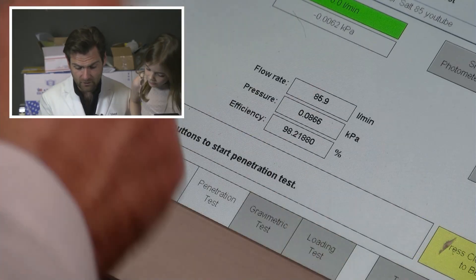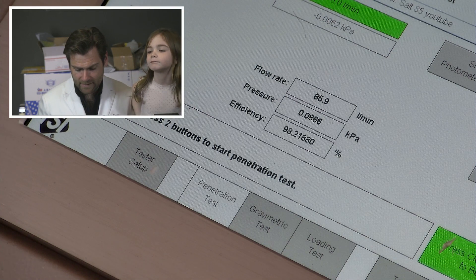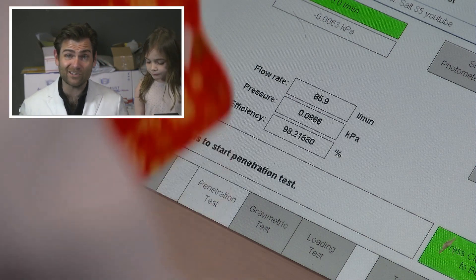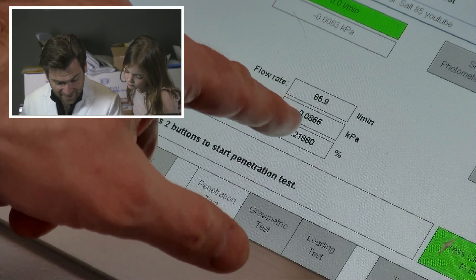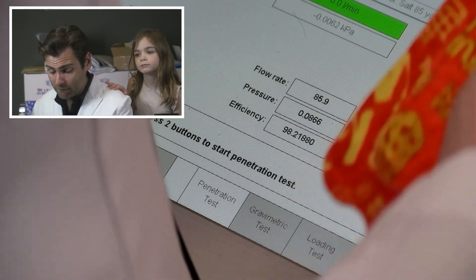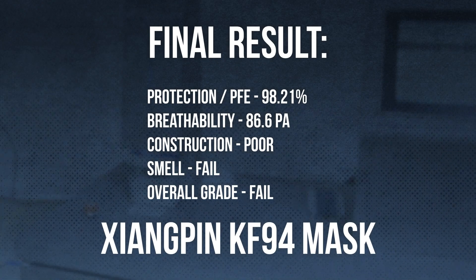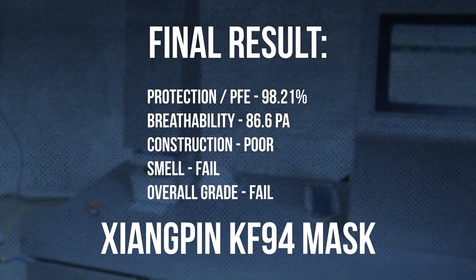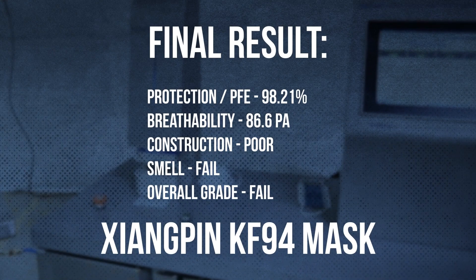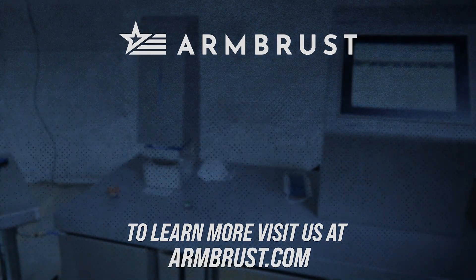It says 98.21. That's a good mask. Very soft — I'd wear that, it's so soft. And the 86.6 pascals — super breathable. So butter cookies, you have found yourself a pretty good mask, I'm going to be honest with you. We'll be right back tomorrow. Thank you.